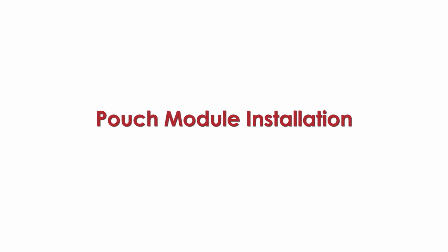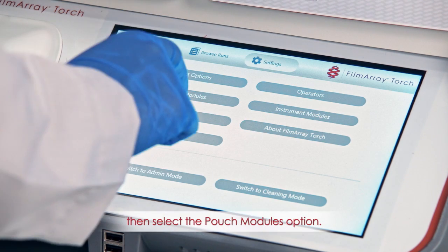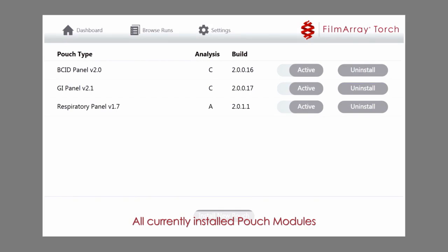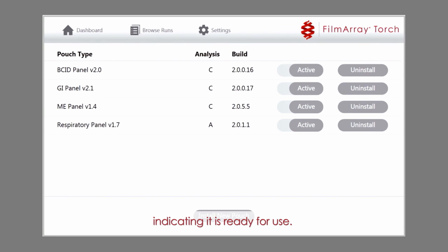Pouch Module Installation. When new pouch modules are received from BioFire Diagnostics, Pouch Module Management must be used to add to available pouch modules. To access Pouch Module Management, navigate to Settings, then select the Pouch Modules option. All currently installed pouch modules will be displayed in an active state. Select Install New Pouch. The new pouch module will then be displayed and set as active, indicating it is ready for use.